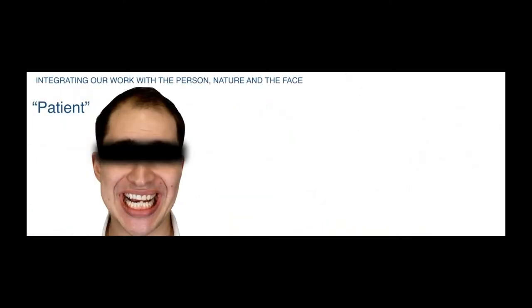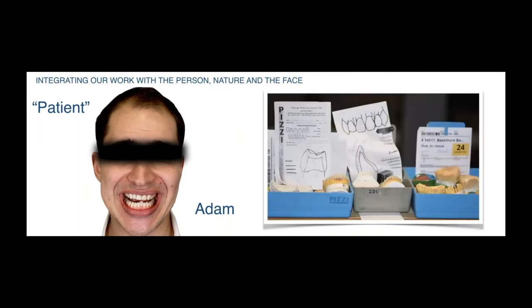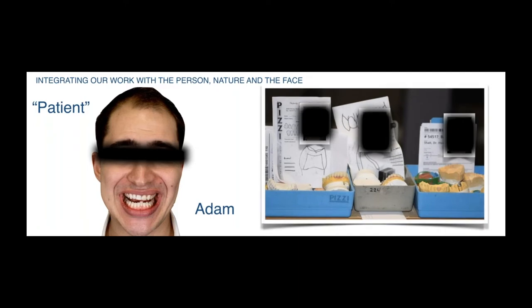So when I look at a patient like this patient, his name is Adam, I want to be able to take all that I see with this patient and transform that into a diagnostic opinion for Adam. One of the things we've incorporated here in my lab, and I've been showing this for the last year or two, is to stop looking at the patients as just a set of casts or models in a box or a pan in your office. So what we've started doing is taking these pans or boxes and actually attaching the patient's face to the pan. I think this is important throughout your laboratory, whether it's shipping and receiving or model and die or billing or whoever it is, to see that case, when they put their hands on it, they're looking at who the human is and not just working on getting a molar out the door as fast as possible.